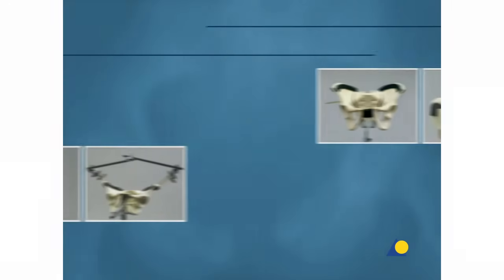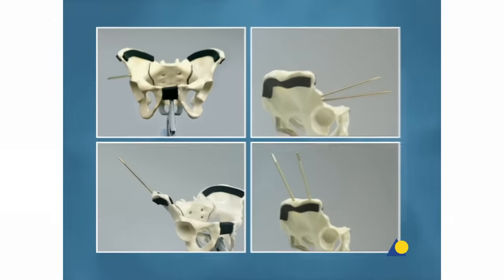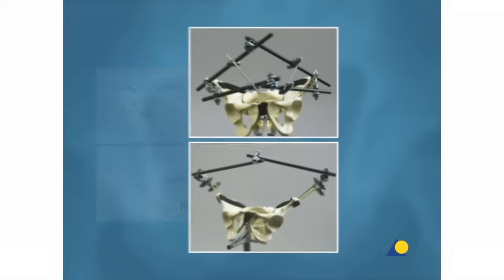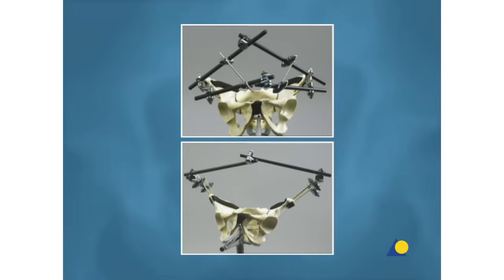This presentation has demonstrated the positioning and insertion of the Schantz screws in the supra-acetabular region and the iliac crest, and the construction of the anterior pelvic external fixator.